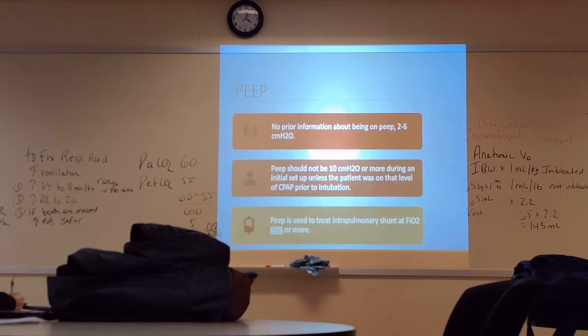We're going to start talking tomorrow about treating blood gases and how we go up or down on the FiO2 versus CPAP scale, whatever they need. We're going to get into that too. PEEP, CPAP, and EPAP are used to treat an intrapulmonary shunt when you've already proven the patient needs an FiO2 of 60% or more. At that point, they're broken, they need more help.